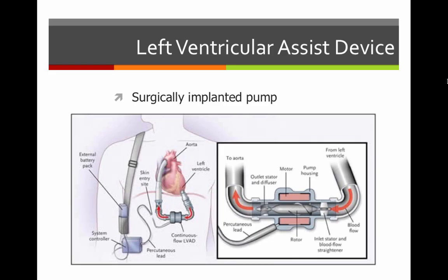And we've got this pump that takes blood from the left ventricle using a motor, feeds it through and over to the aorta and out to the body. So we're using this motorized implanted pump plugged into some sort of external battery pack or home-mounted device. So make sure your patients are always plugged into something or have a harness on, and it is working the left ventricle for the patient. These patients, their left ventricle has completely given up and failed, so this pump is working as their left ventricle.